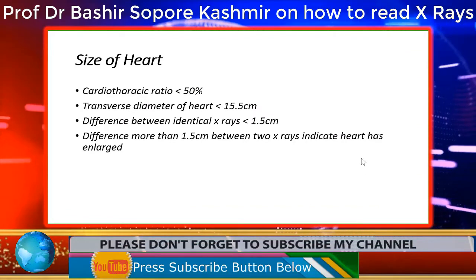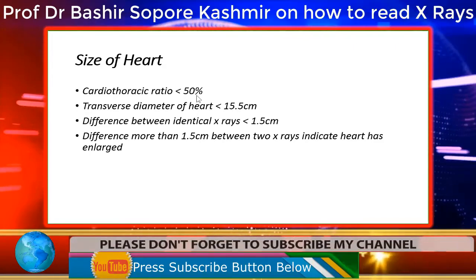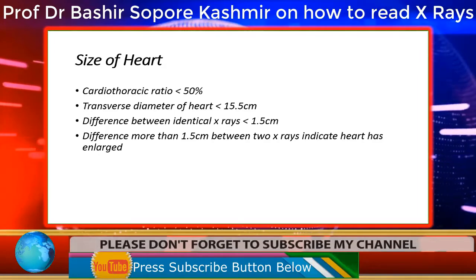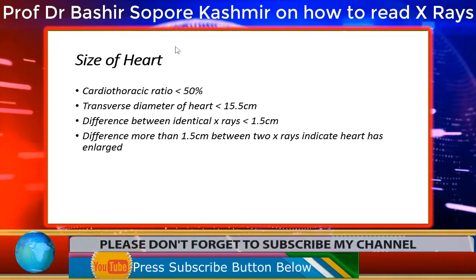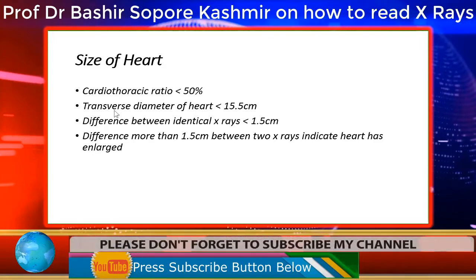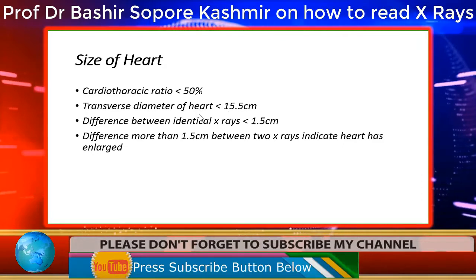Now, size of the heart, as I said, that cardiothoracic ratio should be less than 50%. I have shown you how to measure that. Now, the other finding is that if you find that transverse diameter of the heart is less than 15.5 centimeters, then it is normal.